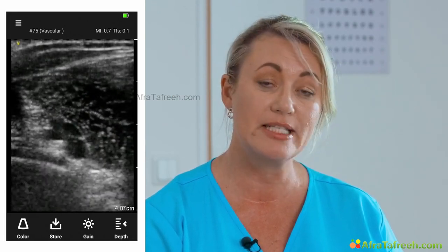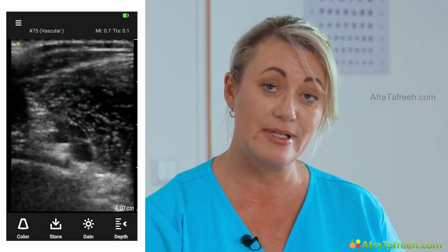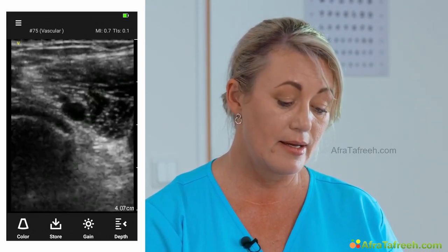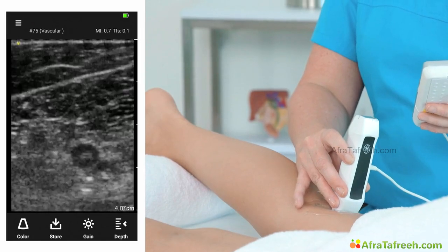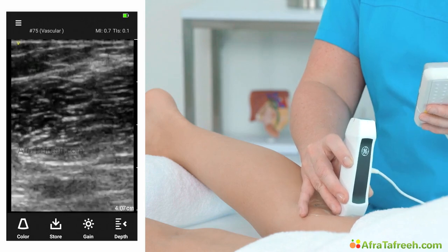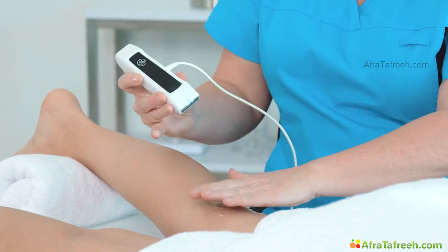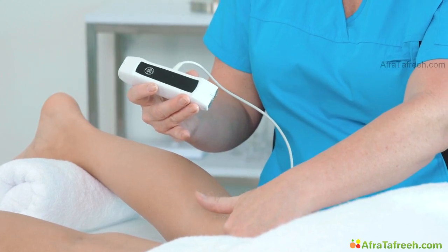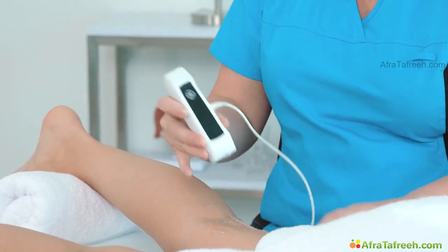This is because the popliteal vein now has some of the branches coming off, which may include the short saphenous vein, the gastrocnemius or soleal vein branches. They're all compressing nicely, so we're going to make our way cephalically, compressing as we go. Again, you can see the vein there coming now side by side next to the artery. Once we get to a level that's about a handspan above the knee crease, we know we've overlapped from our medial scanning aspect. So we've pretty much covered the entire femoral vein to popliteal vein region.